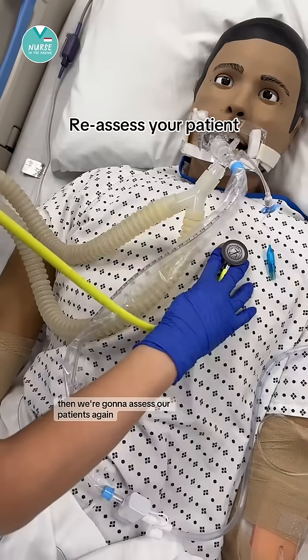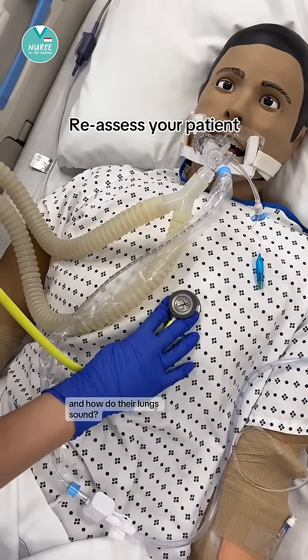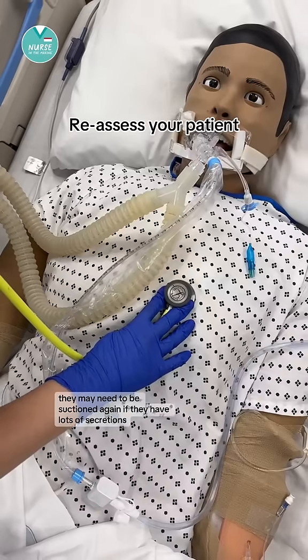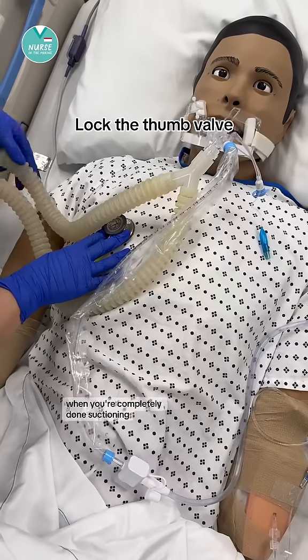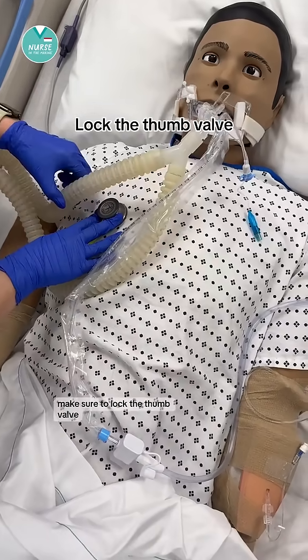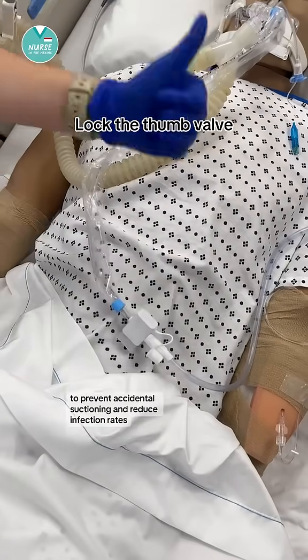Then assess your patient again. How do their vital signs look? Do they seem to be breathing easier? And how do their lungs sound? They may need to be suctioned again if they have lots of secretions. When you're completely done suctioning, make sure to lock the thumb valve to prevent accidental suctioning and reduce infection rates.